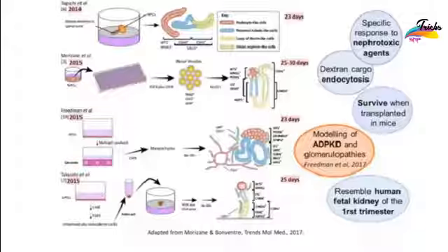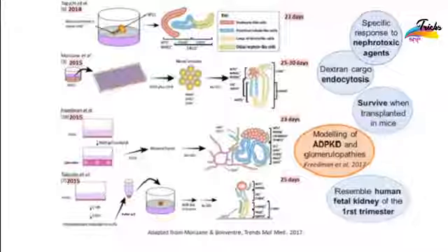Other laboratories, as you are probably aware, have also been showing the potential of human cells to give rise to kidney organoids. These use different signaling pathways, with different chemical compounds and growth factors that are mimicking important steps of kidney development in the petri dish. So we compared these different protocols in terms of the time length, and also with regard to the differentiation potential of these kidney organoids.